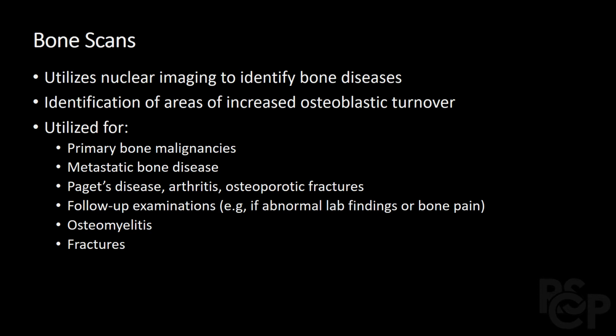They're utilized for a variety of reasons. They can be used to identify primary bone malignancies, metastatic bone disease, Paget's disease, arthritis, or fractures, or in some cases for follow-up examinations, for example, if there's abnormal lab findings or unspecified bone pain. They can also be used to identify osteomyelitis and fractures.